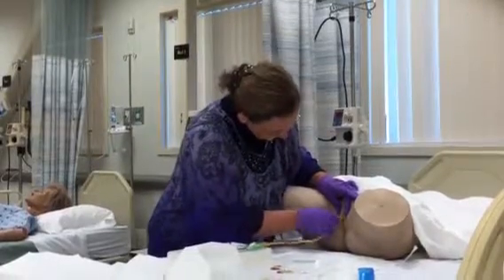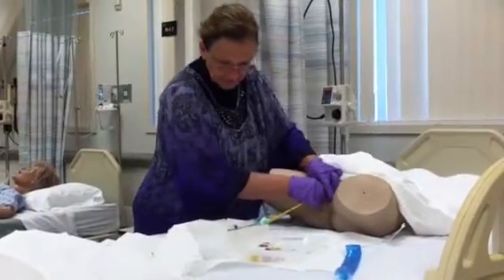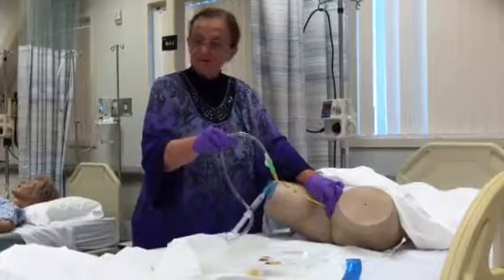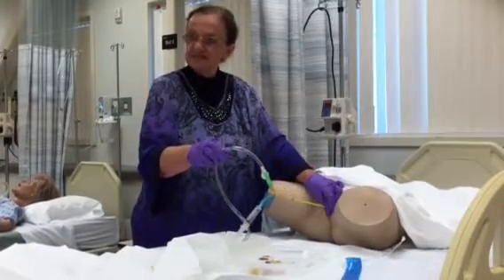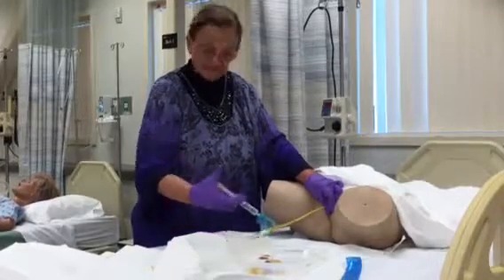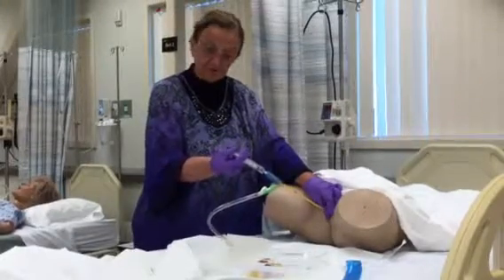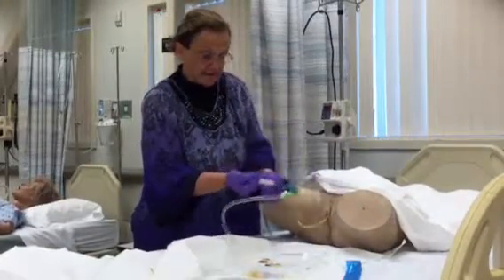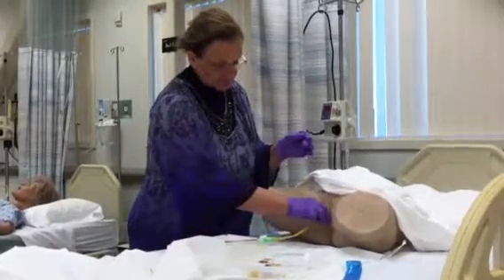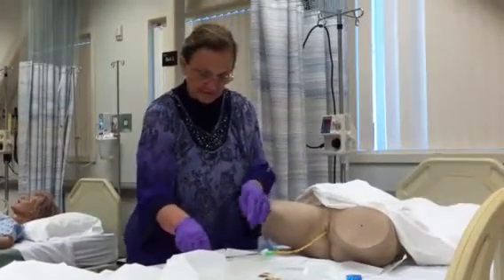And I've got my catheter gooped up, and I'm going to go ahead and insert the catheter until I see urine coming out of the tube. If I see urine inside the tube, I know I'm in the bladder. And then I'm going to inflate with my syringe. You with me? And I'm going to disconnect it. Then I'm going to gently bring the catheter back, and the balloon will hold the catheter in place.